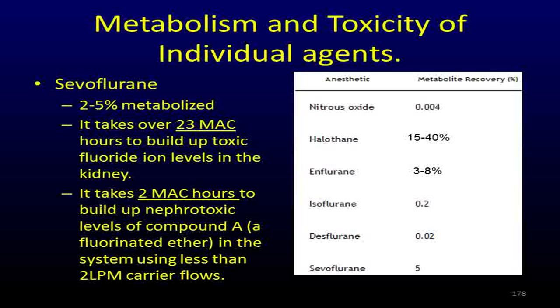What does that mean? Flow rate is just what's carrying the gas. I told you that with high flow rates, you don't even have to worry about this calculation. If you're over 2 liters per minute, you are carrying enough gas past the circuit, and it's going to escape out of the exhaust and into the scavenger.